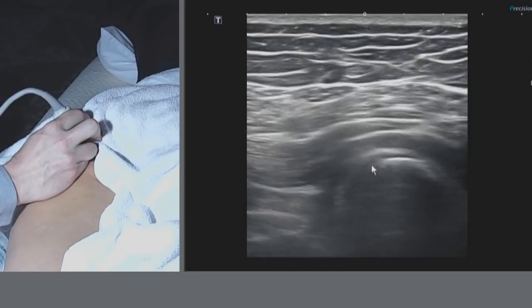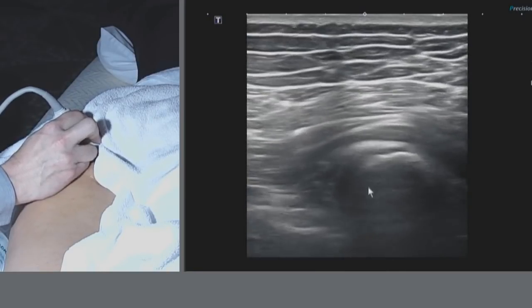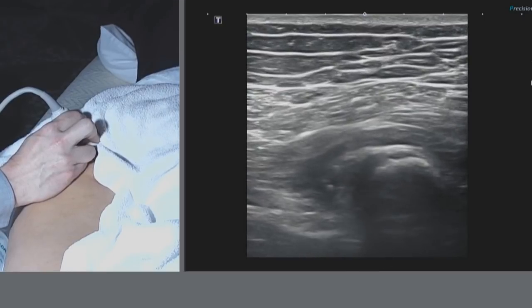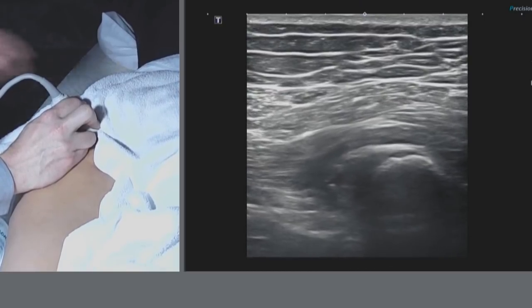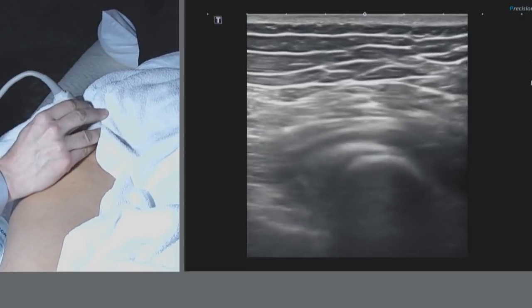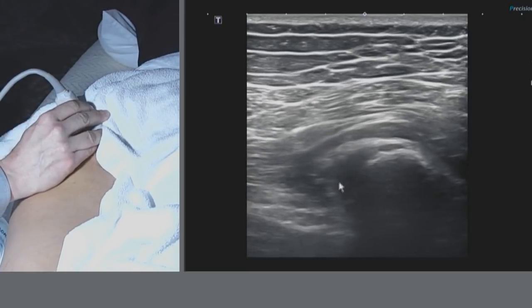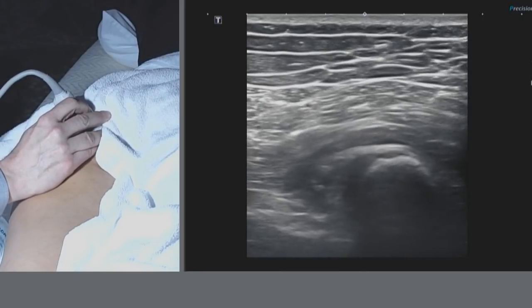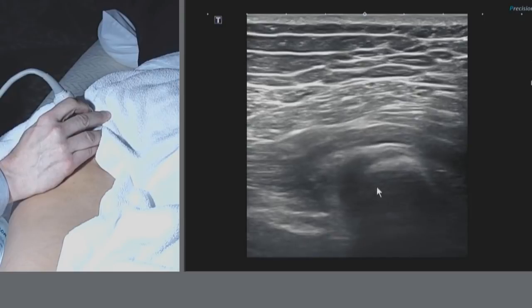Now remember the two tendons that attach here. The one that sits around, let's say, 11 o'clock is the conjoined attachment of the semitendinosus and long head of the biceps femoris, so that's located more superficial. The one that's more lateral, down the slope, is the semimembranosus. They often look hypoechoic, and just like on an MR, they often look gray. It's an asymptomatic finding, so make sure you don't overcall tendinosis.